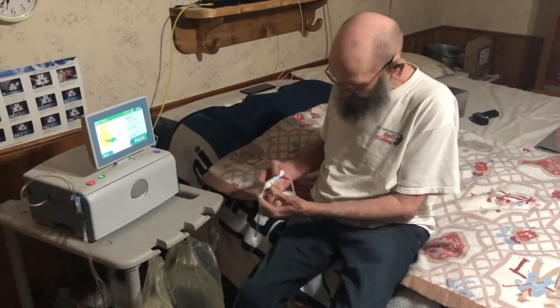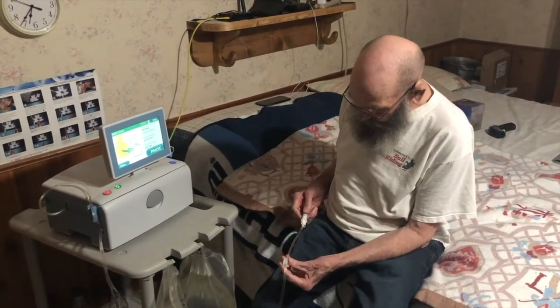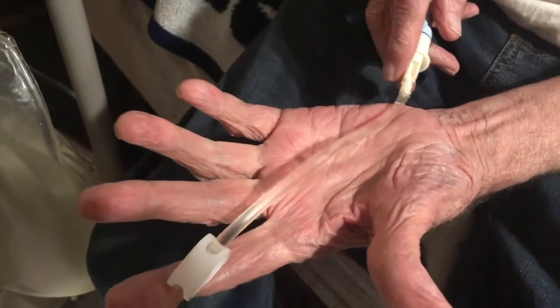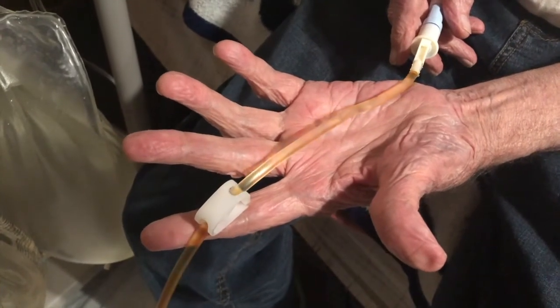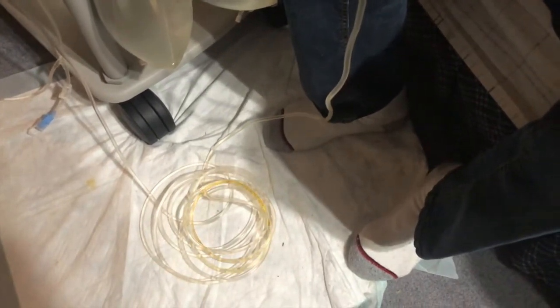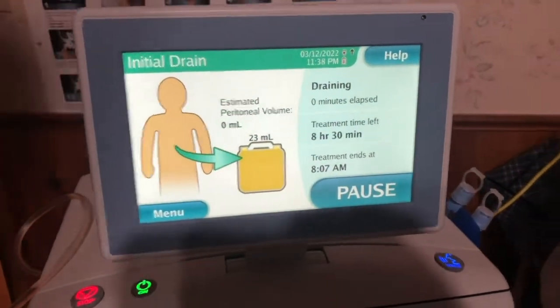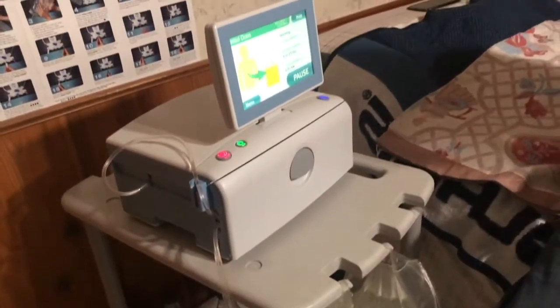And now this thing's going to start pulling fluid out of me, and you'll see that iodine come down the tube when it pulls some out of there. When it starts pulling it out, that'll show that iodine in that tube right there. And it looks like it got a pretty good, probably 10 or 12 cc's come out of there. 23 cc's, boom, just like that. So that's a really good sign. Everything's working good, and it's pulling another big long line out of there. You see, look at there, 46 out of 67. Holy crap, Pete, we may be in for a record tonight.